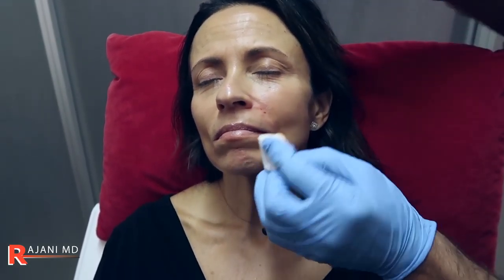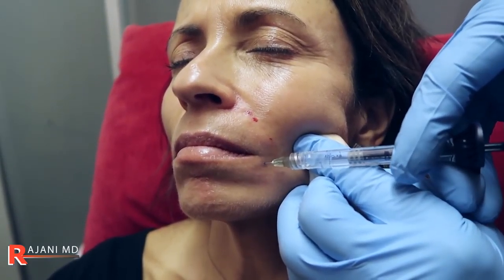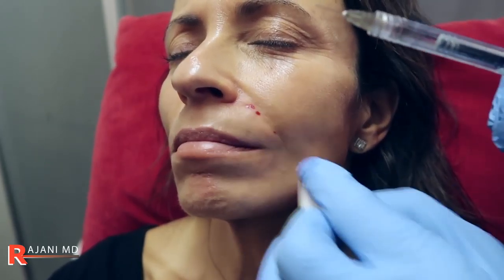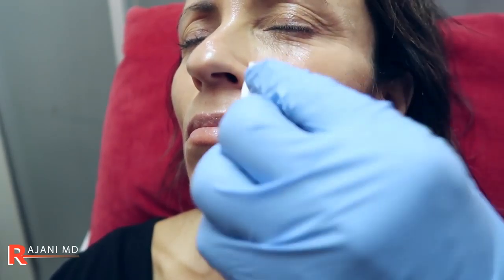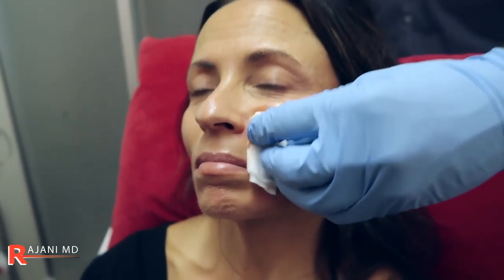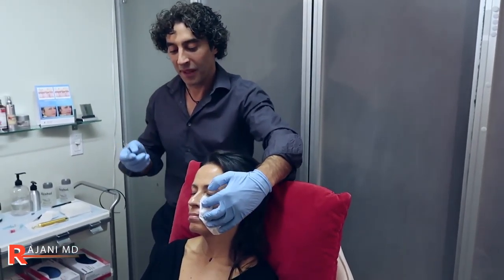I'm going to put a little at the edge of the mouth to show you the droplet technique down here. Here's the modiolus — there's a little bit of volume loss here. A little stick coming in. I pull back and I'm putting again 0.05. Not a lot, but we know if we support that edge of the mouth it gives a lift up. I'm going to put a tiny bit at the edge of the mouth, then supporting the modiolus in an upward fashion. One more poke — there's lidocaine in here. And that shows the edge of the mouth and the nasal fold with Restylane Define.